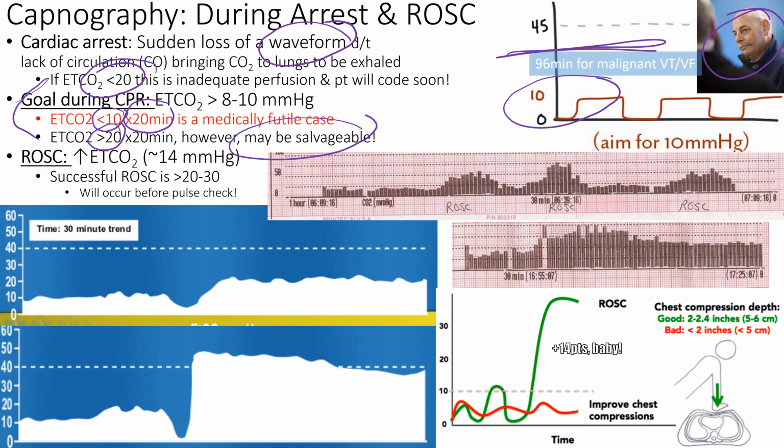There are other medication strategies you can do. For VT storming, you can put 2 Zolls on the patient and shock them twice. Don't do it unless someone's supervising you, because if you overlap them, you can destroy the other Zoll, and it's like a $20,000 machine. So you just have to do it with someone who knows how to do it. You can replace things around, you can do stack shocks. There's all kinds of things you can do with someone who is VT storming like that.